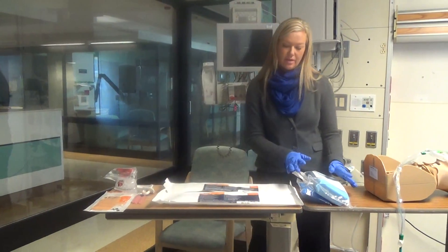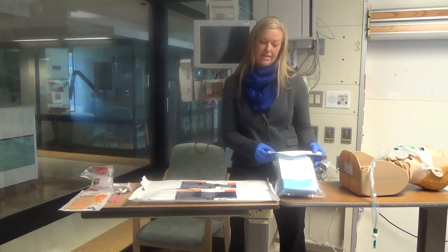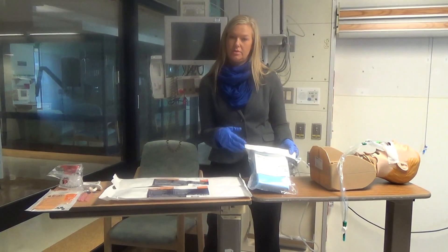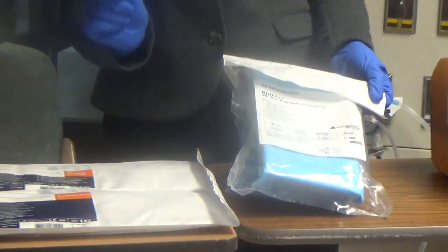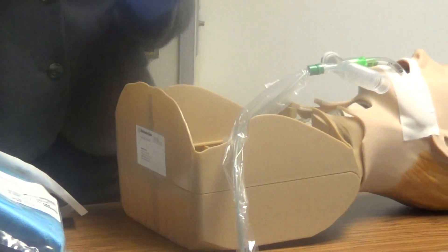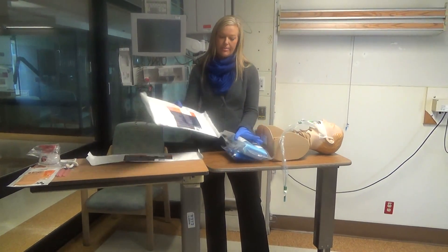The other item you'll need for your procedure is the mini-BAL prep pack or prep kit. This includes everything needed to complete the procedure, including saline, syringes, the Lukens trap, and the adapters. Since our patient has a 7.0 ET tube, I would select the larger mini-BAL from the supply cart and one of the packs.